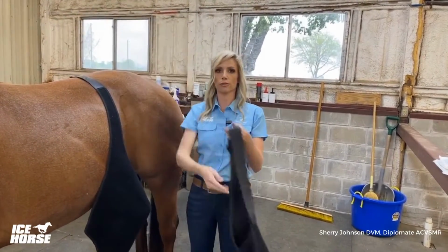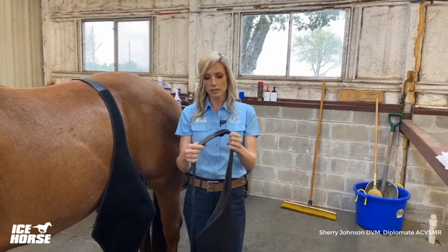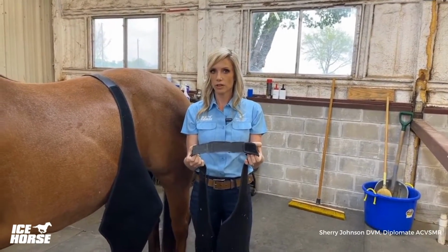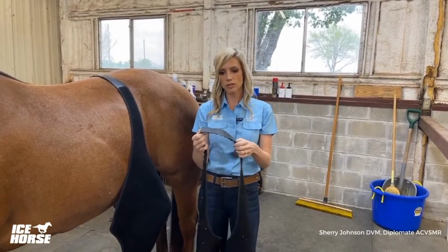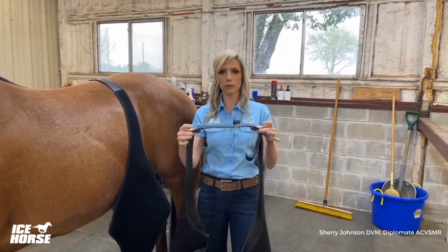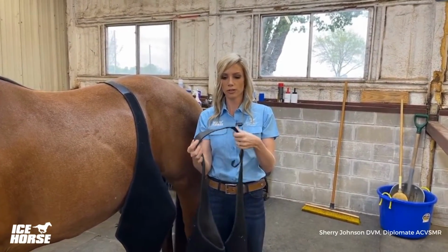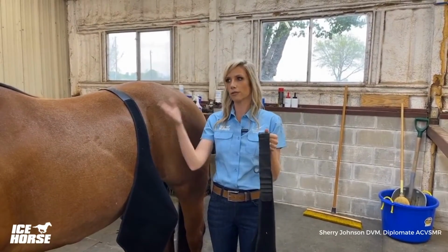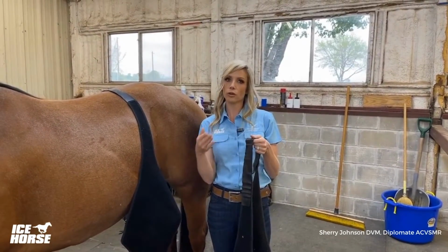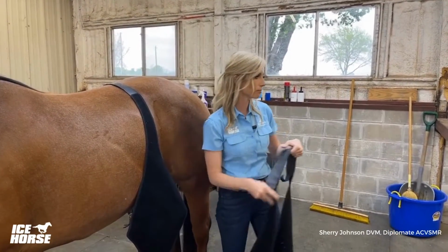So you don't have to go through the process of unvelcroing and re-velcroing. And depending on the size of horse that you're using them for and the variation in those sizes of horses, you can actually label which wraps are fitted to which horse. So for example, we'll have a pair labeled for this particular horse and a pair labeled for that particular horse, so that we don't have to adjust the size and it's just ready to go every single day.